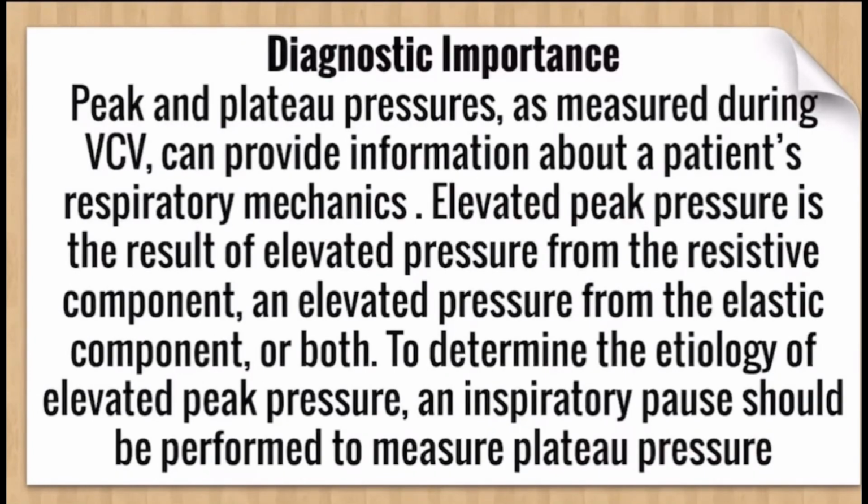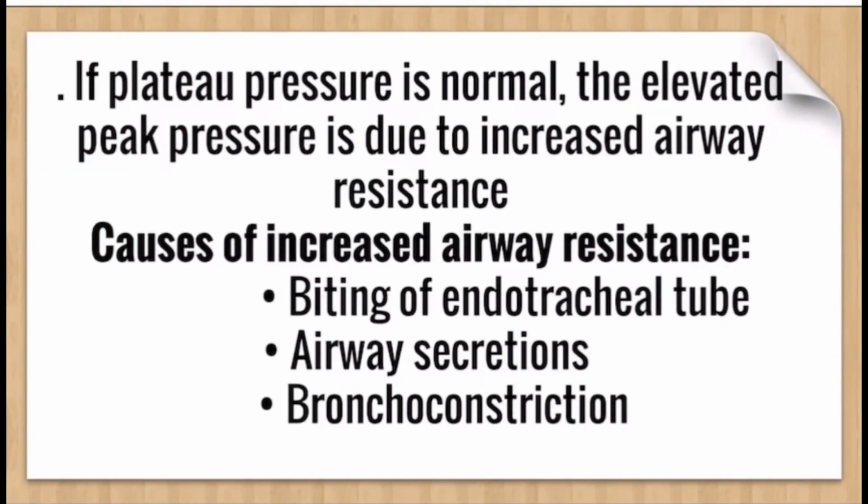To determine the etiology of elevated pressure, an inspiratory pause should be performed to measure the plateau pressure. Now, if the plateau pressure is normal, the elevated pressure is due to increased airway resistance.